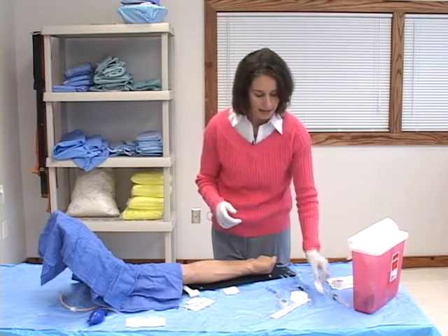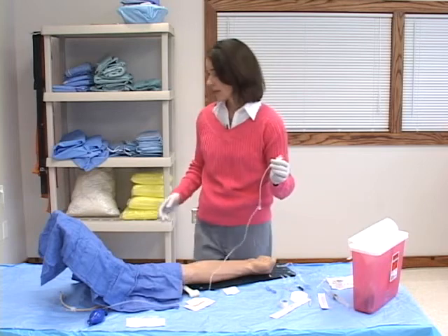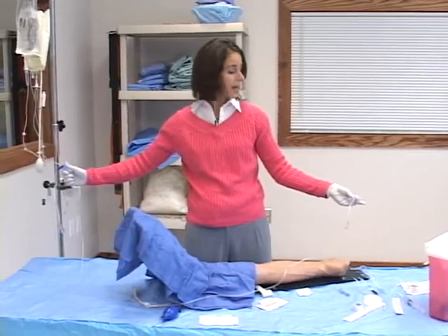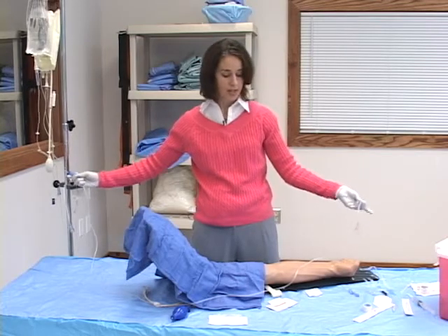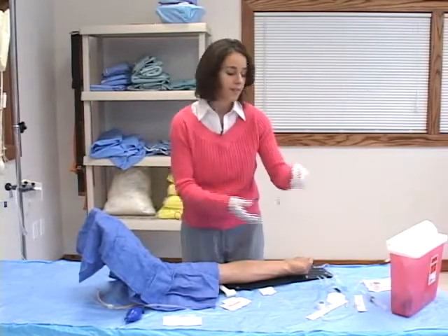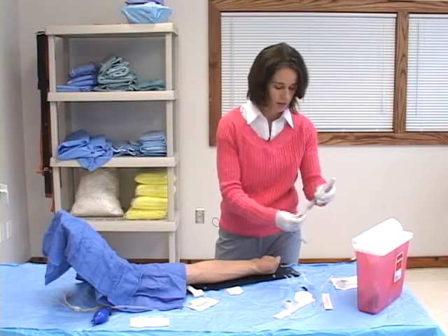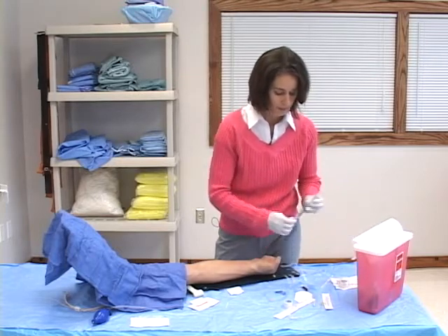So you get your IV catheter ready. You want to have your IV tubing ready, and what I do for the IV tubing is I go ahead and run the saline through it and make sure that there aren't any air boluses or air emboli that could be in there. So I'm going to run the fluids through it till it drips and stop that. So the IV tubing line is prepped. I'm going to have this connector, and I would flush this with saline prior to starting to make sure there isn't any air in this line. So this connector is ready to go.